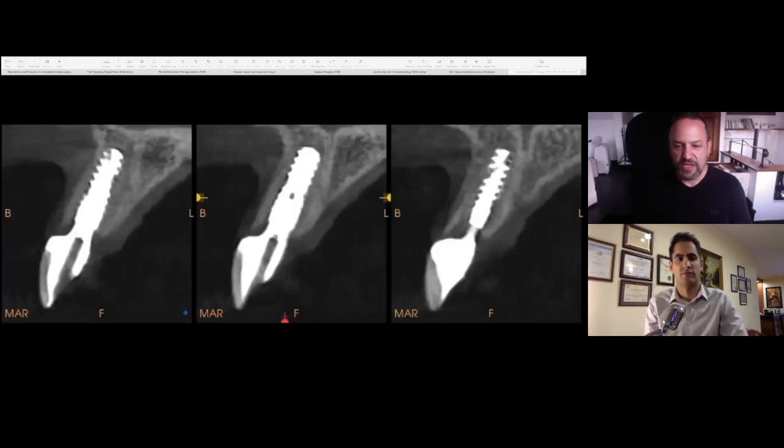And here you can see from a CT point of view what everything looks like. You can see how beautiful everything is. We've still maintained our bone. You can see over here how the buccal bone's been maintained in that position. And really, in my opinion, it's just the next level technique. It's just the socket shield, brilliant. Again, kudos to Marcus Hursler.